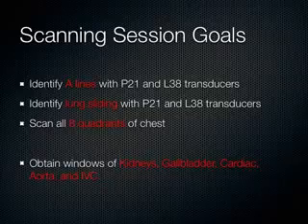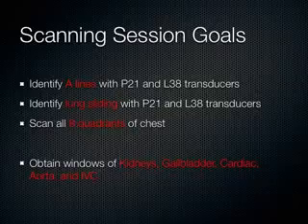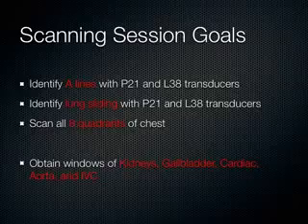And with what time you have left, practice your views of that pleural space. Look for fluid in the pleural space, Morrison's pouch, splenorenal recess, and anything else that you feel like you need to review, because you'll have extra time today.